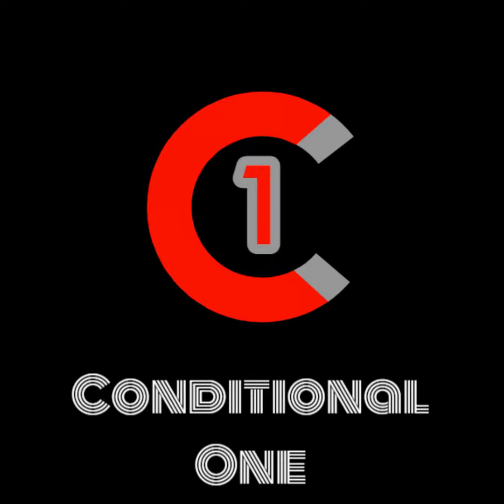This is known as the spatial gradient, which is often abbreviated to dB over dx, or change in magnetic field over change in distance. This is measured in Tesla per meter, or Gauss per centimetre? Remember, I told you that 1 Tesla equals 10,000 Gauss. Okay, so 1 Tesla per meter equals 100 Gauss per centimetre.